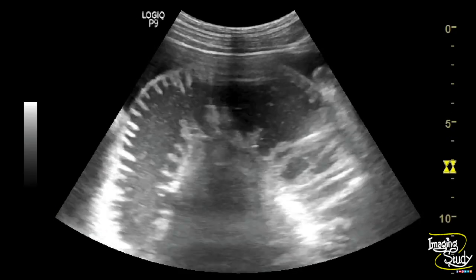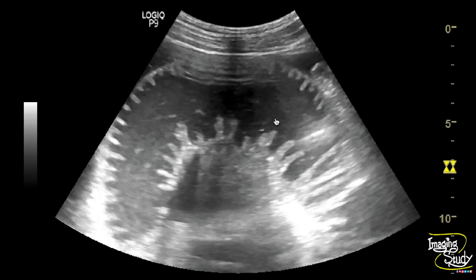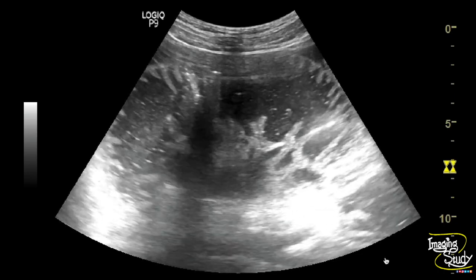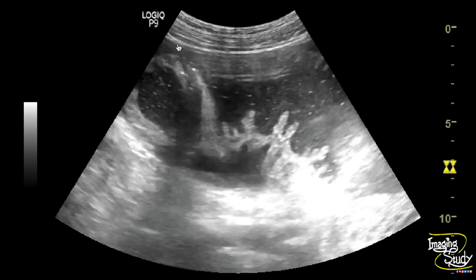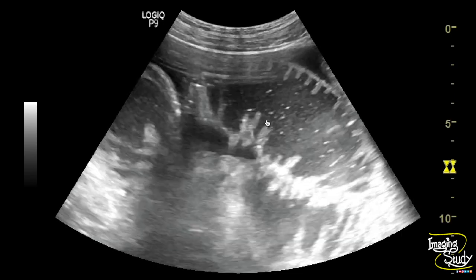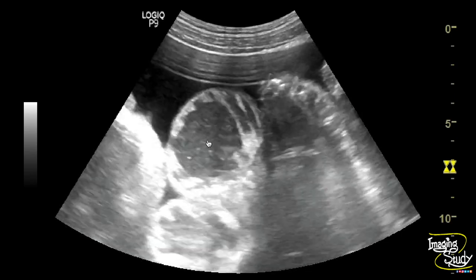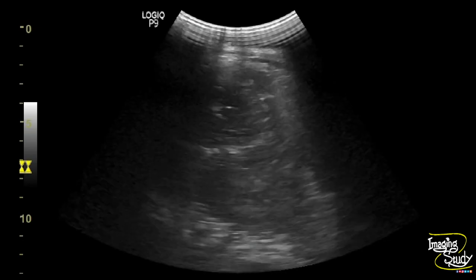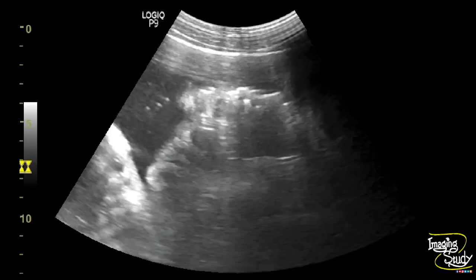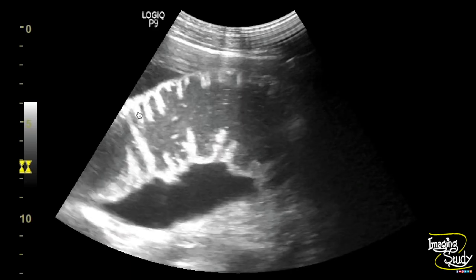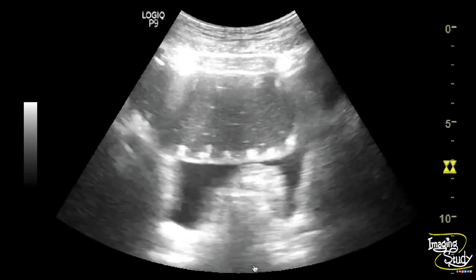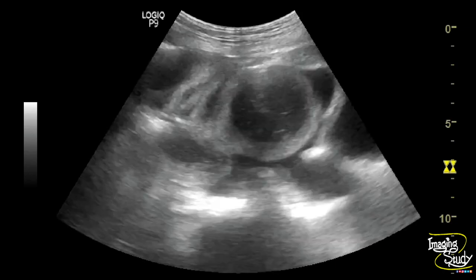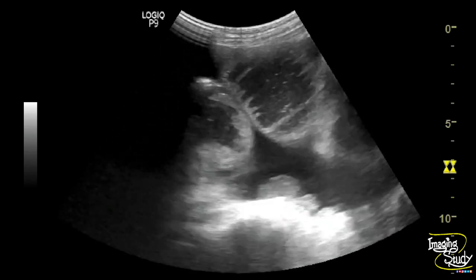Here you can see the dilated fluid-filled small intestinal loops with internal to-and-fro flow and adjacent peritoneal collection. You can see the valvulae conniventes, indicating the features of small intestine. These to-and-fro flows are not passing distally — the flow is going and getting back. This feature suggests a case of small intestinal obstruction.